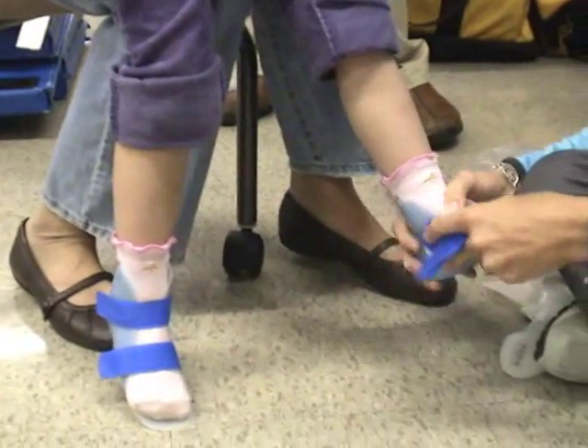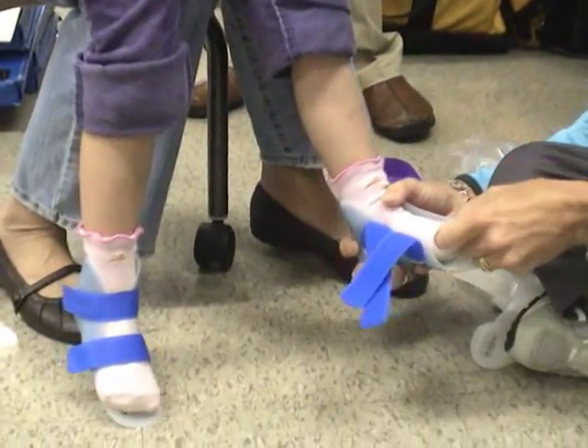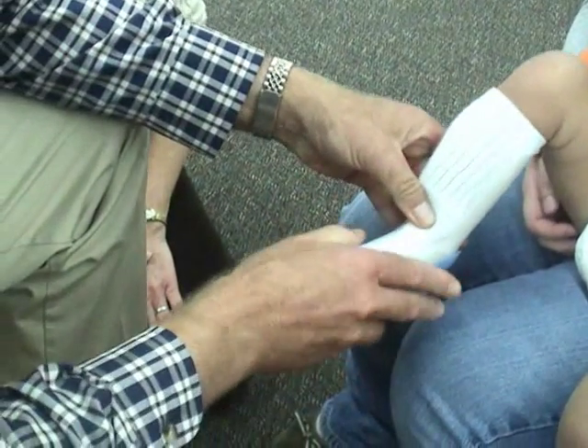When fitting the jumpstarts, we initially try to seat the heel, because that's our primary control — to hold the heel down into the back of the brace.